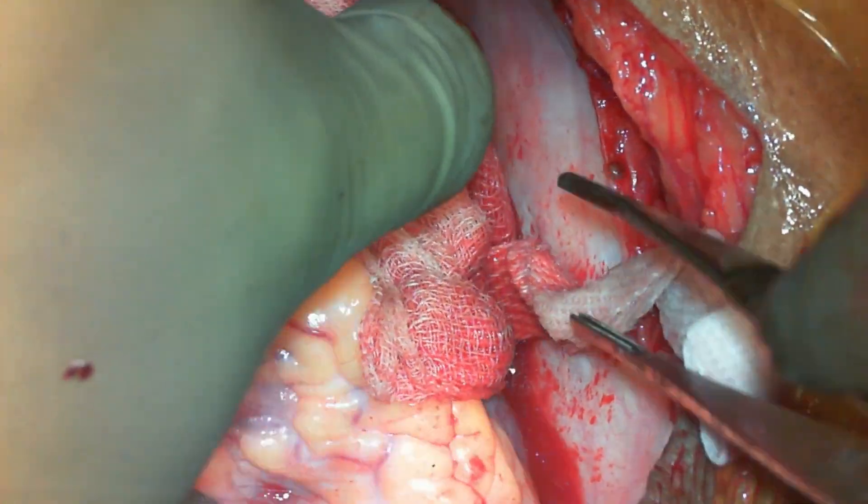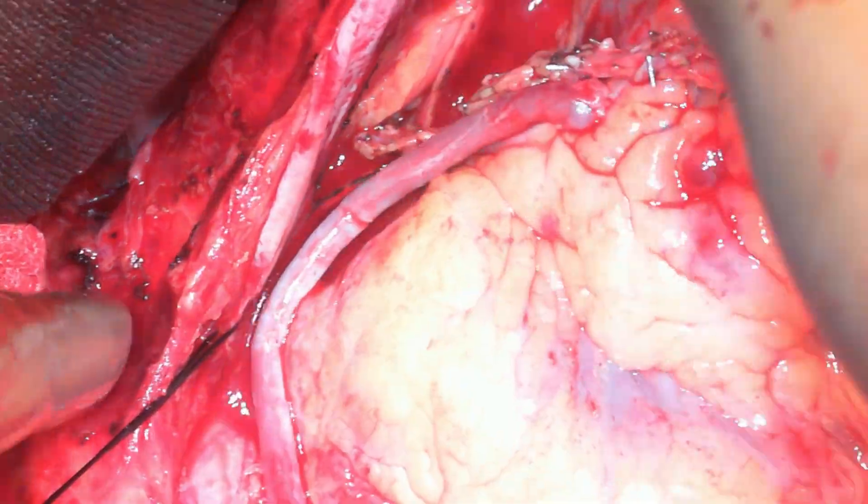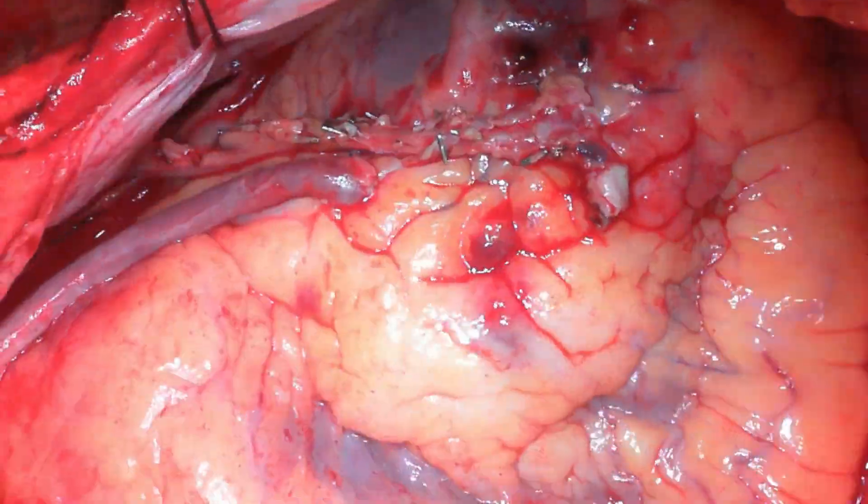One has to assess this especially when you take the packs off the posterior LV wall and allow the LV to go back to its normal anatomical position, with normal ventilation and normal tidal volume.